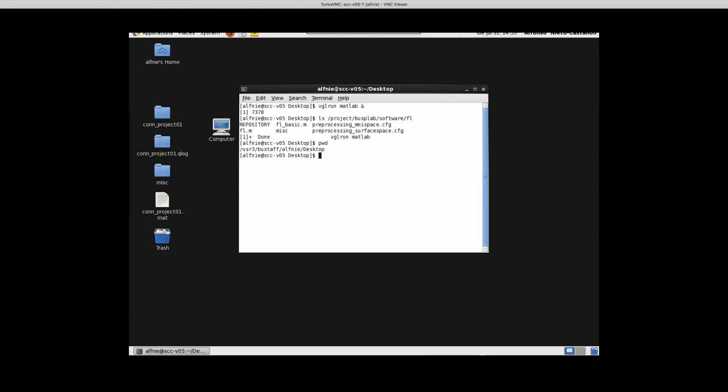With the caveat that I don't think it'll make a whole lot of difference, and it may be that it's just fine. If your answer is that's how FreeSurfer works and it's the easier way to use FreeSurfer, that's fine too. Right. It makes it a little more complicated to keep the different number of vertices per subject all the way up to the second level analysis, and it kind of defeats the logic of how we preprocess the data.